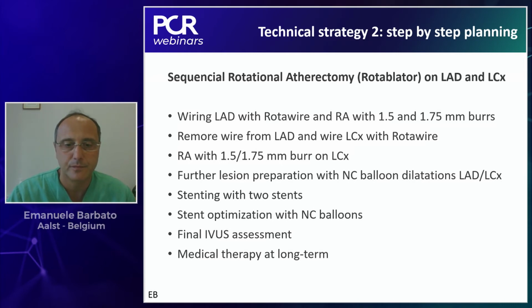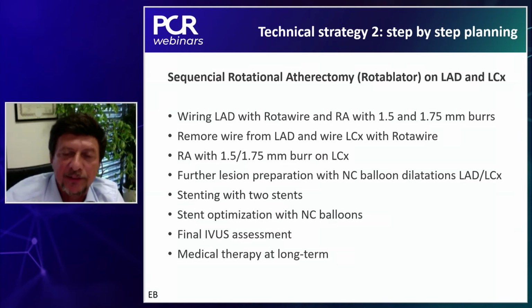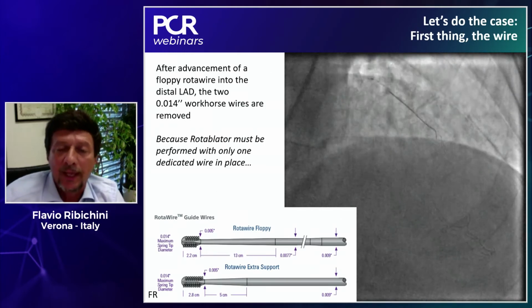The plan is clear. I mean, everything is good when you can stick to the plan, and this is what we are going to try to do. So let's start doing the case, and the first thing is putting the wires.